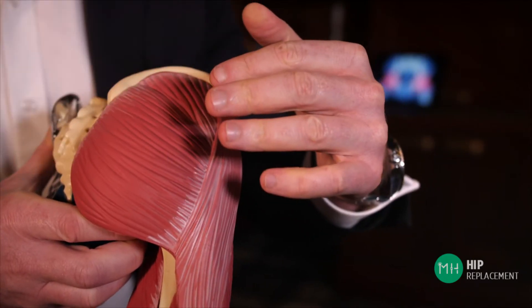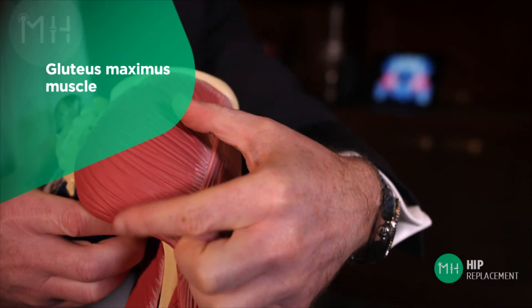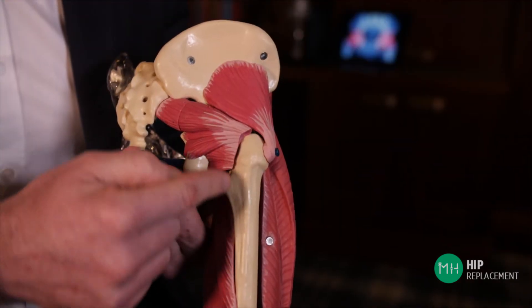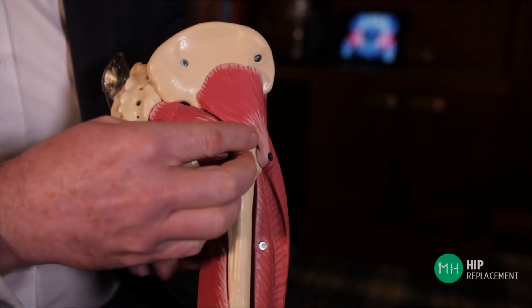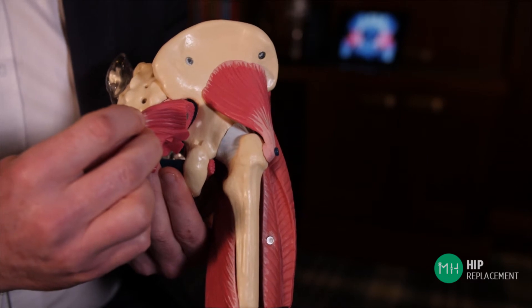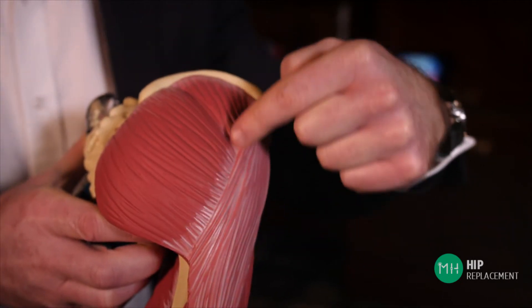The posterior approach, as the name suggests, replaces your hip through your bottom muscles. A surgeon separates the largest muscle in your body called the gluteus maximus, located just under the skin of your buttocks. The surgeon then detaches some tendons around the bone of your hip to expose and replace the joint. At the end of the operation these tendons are repaired back to the bone with suture material, and the gluteus maximus muscle is also repaired back together with sutures. I only use the posterior approach in a small number of specific patients, however many surgeons do use this approach for all their patients and the outcomes are very good.